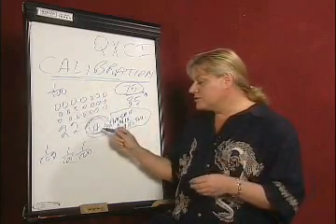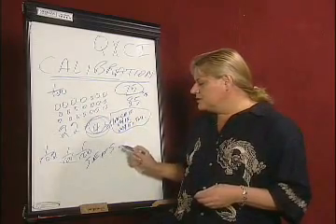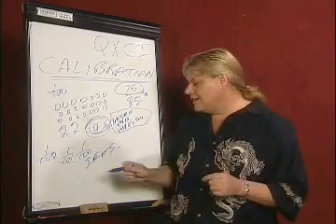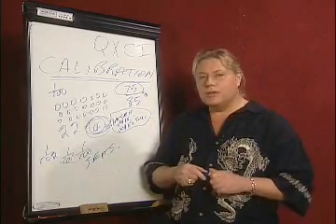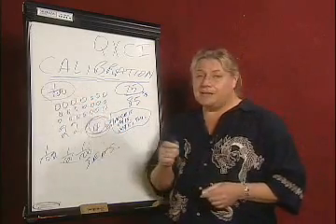It calibrates to the speed, then it's going to calibrate to the sensitivity by measuring the different voltage and amperage, and in being able to measure the sensitivity of the patient on the VAR hope. So this type of calibration is all done within 10, 20 seconds, done simply and easily, automatically by the computer, because the human being can't perform at this level.